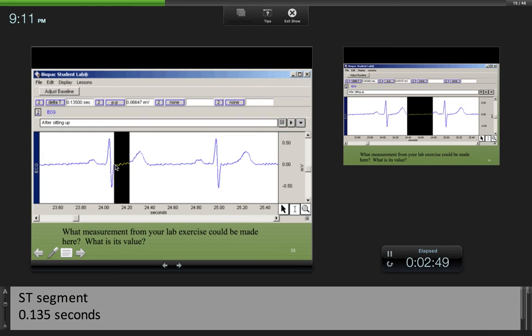Here we have QRS, and this is T, so this is the ST segment. Delta T will give us its value.